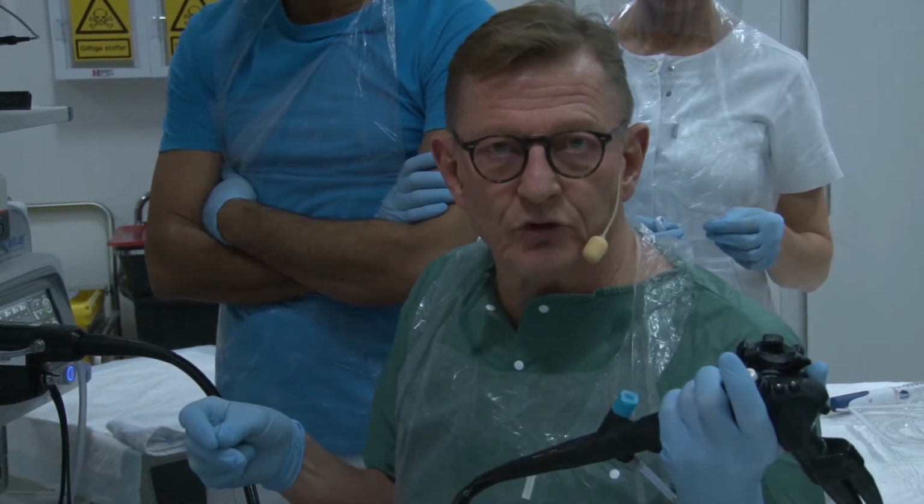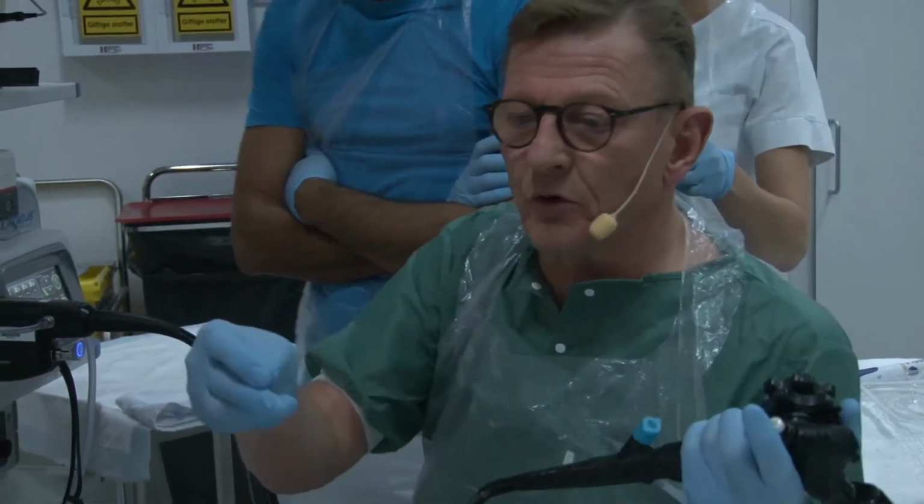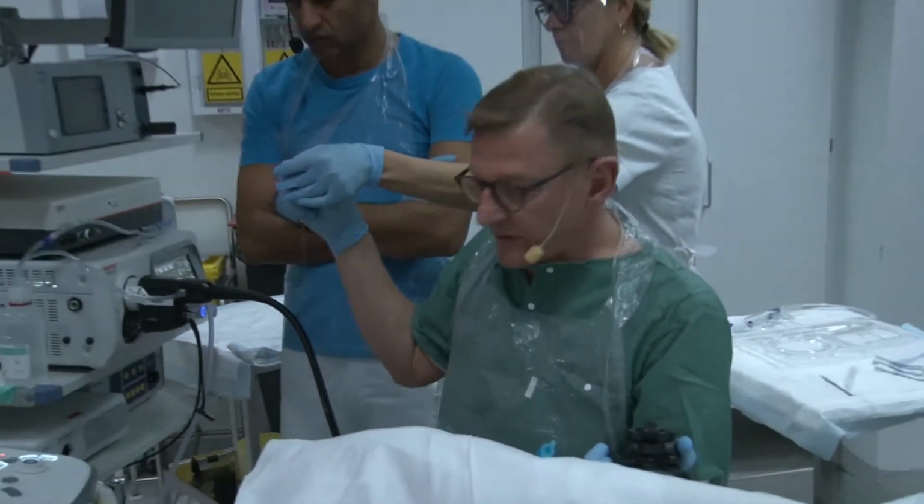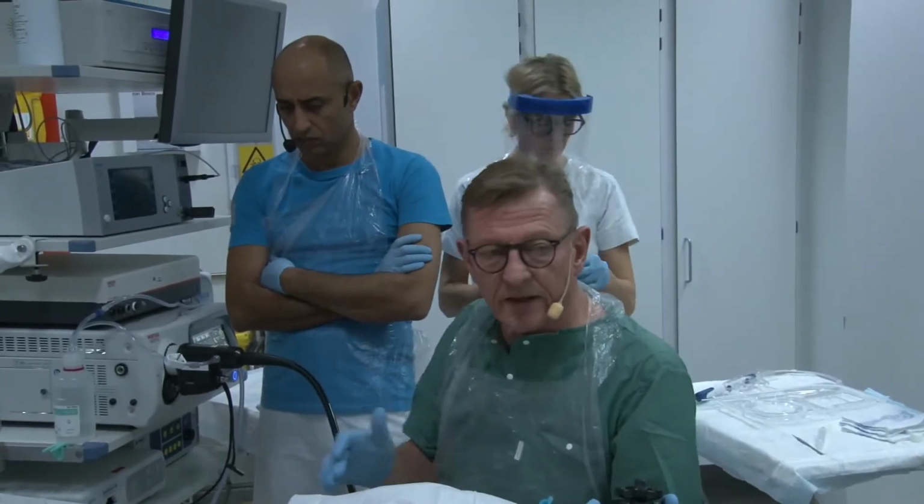I just wanted to show you the microbiopsy forceps. If I hold it against this and then open it and close, open and close. Can you see how it manually can open and close? What we usually do is prepare the microbiopsy forceps within the needle.